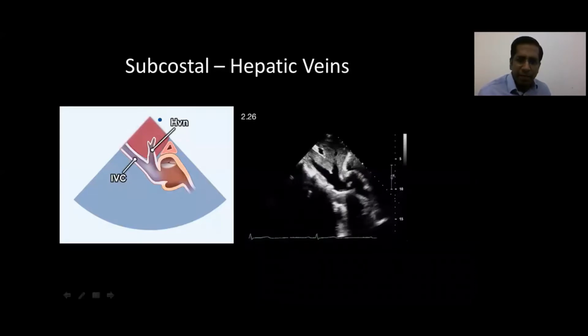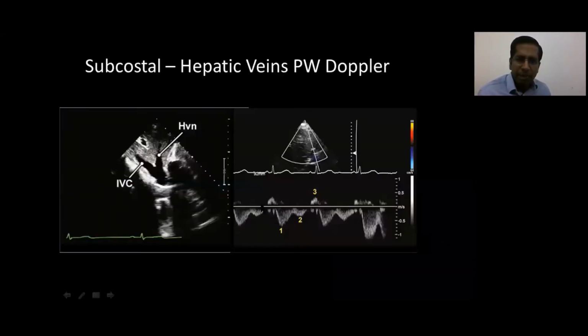Again, like I said, sometimes we get very flustered when we look at these images and we don't know what is happening. Always have an ECG. It will solve a lot of problems and it will really enhance your learning. So, except for this COVID season, I would like to reiterate that we should be using ECG for every examination.